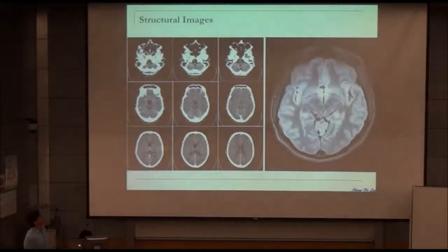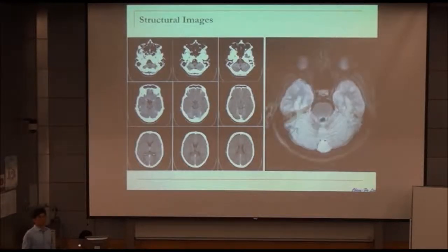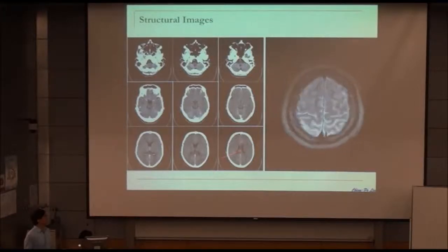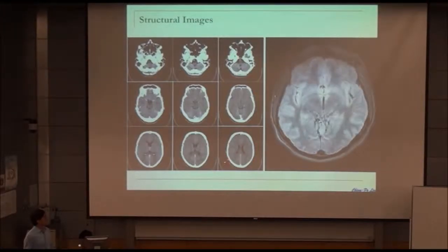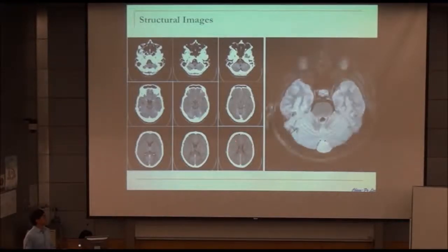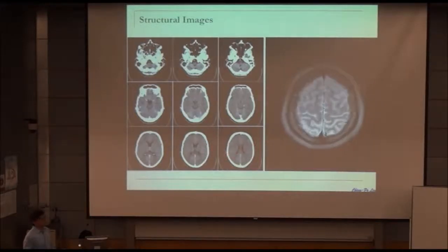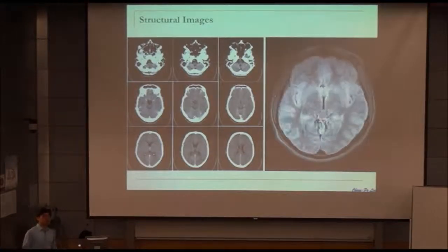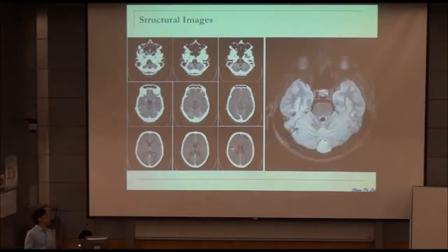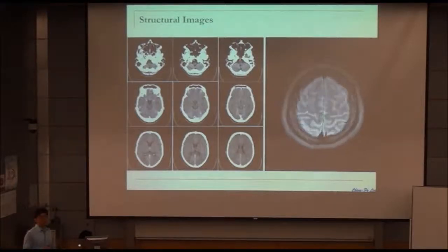So we can see the CT results here. We all know that the source is X-ray, a kind of radiation. When the X-ray penetrates the brain, there is some signal attenuation due to the bone, that is solid tissue, or the soft tissue of the brain. So you can see different kinds of contrast. However, for such X-ray measurement, the contrast is poor. Compared to MRI, the contrast is very, very poor. However, it is a very convenient technique.